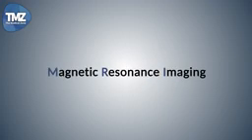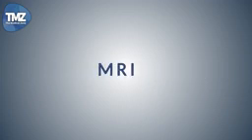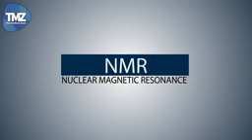In this video we'll have a look at some of the basics of magnetic resonance imaging, abbreviated and more commonly known as MRI. By use of MRI you are able to visualize detailed anatomy in all three planes, so axial, sagittal and coronal. The MRI uses a technique called nuclear magnetic resonance, and its function is actually based on the magnetization properties of certain atomic nuclei within the body.